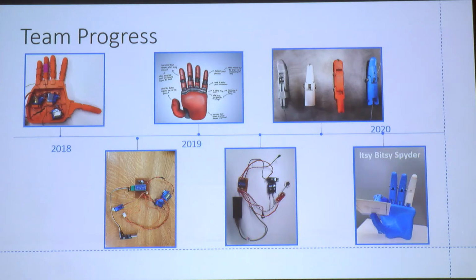And in our latest design, all of these things have been improved. The palm has been completely redesigned and looks more anatomically correct. Even though we want to focus on the uniqueness of deficiencies and empower that, we found it important that it mimic it a bit more, as well as to get a more natural grip. The fingers have become a lot stronger and have a larger range of movement, which allows the hand to grab a lot of different objects now. They designed a wrist, so it's possible for the hand to rotate in this direction as well.